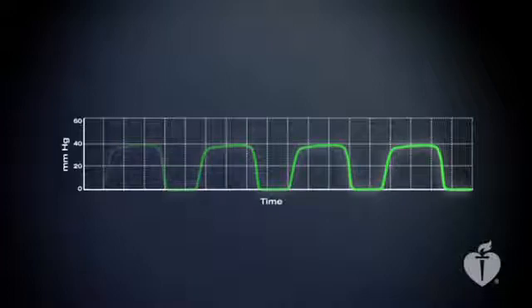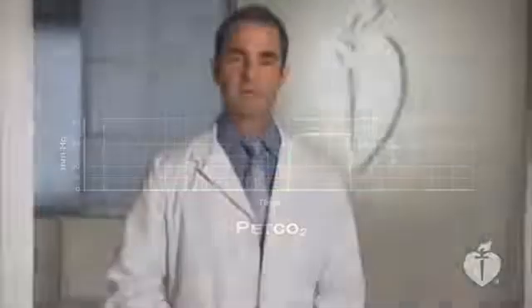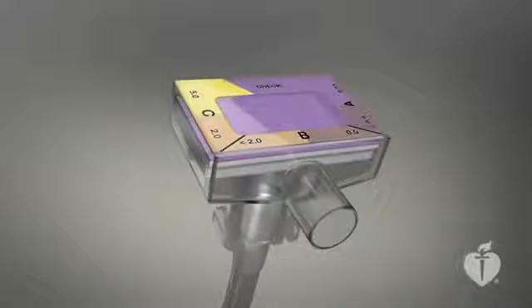Even when the healthcare providers are properly ventilating the patient, ineffective chest compressions will produce a low end-tidal CO2 reading. In contrast, ROSC can cause an abrupt increase in end-tidal CO2. Another type of CO2 detector, the colorimetric end-tidal CO2 detector, simply changes color when it detects CO2. Although this can be helpful to confirm the placement of an advanced airway when waveform capnography is not available, studies indicate that these devices are no more accurate than watching for chest rise and other clinical observations.